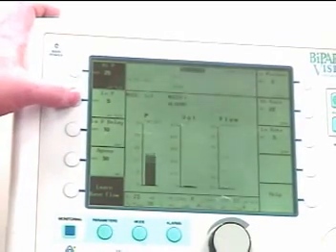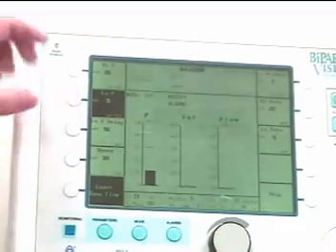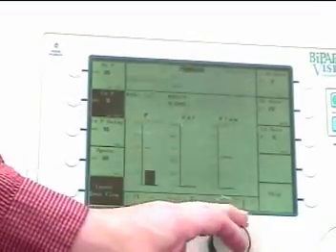And then we'll have low pressure, which is based on the EPAP. And we'll go somewhere between 0 and 5, so we'll take 3.